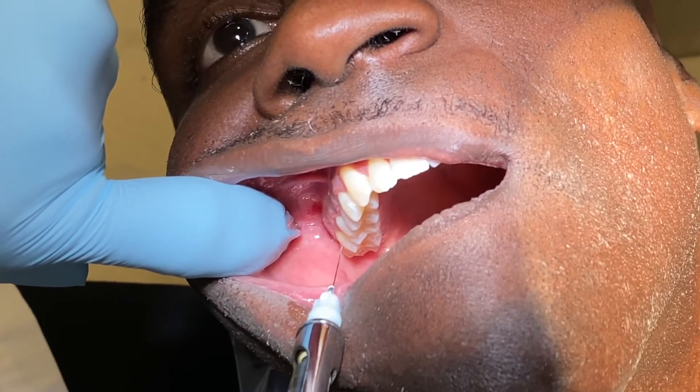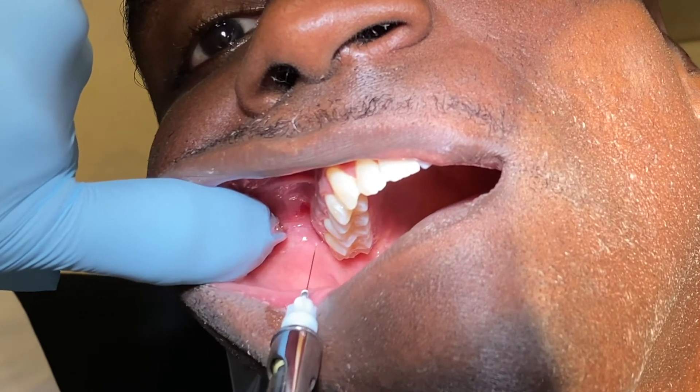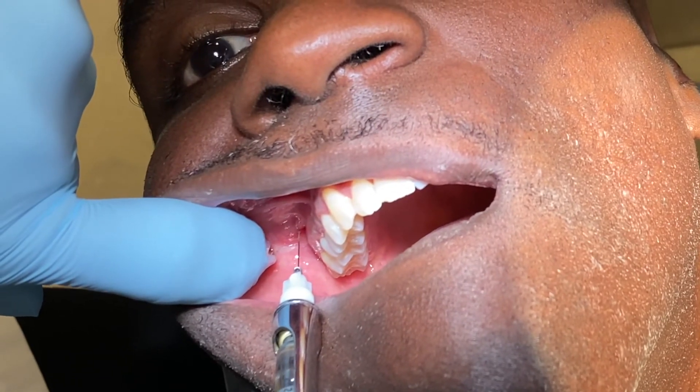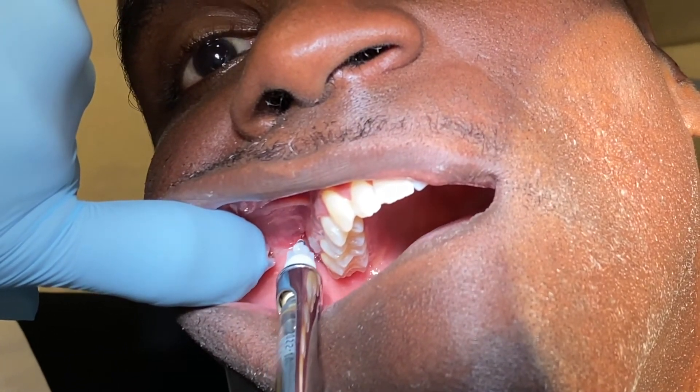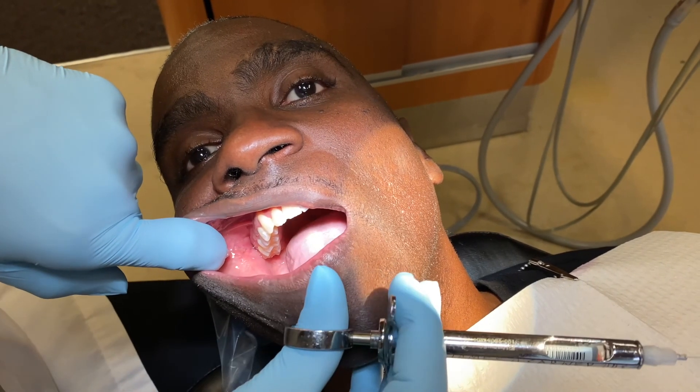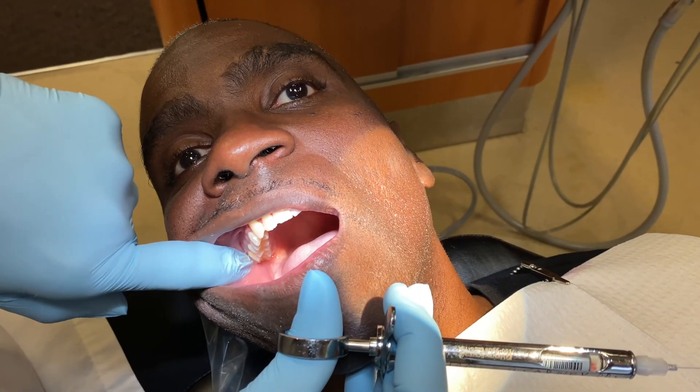Just distal to my second molar, I will inject just slightly under the tissue, and then continue all the way up to almost within a millimeter or two of the hub, and inject the rest of the carpule. On the maxillary, the chances of injecting into a vessel are very slim, and that's going to allow all of my molars — my third molar, my second, and my first molar — to be anesthetized.